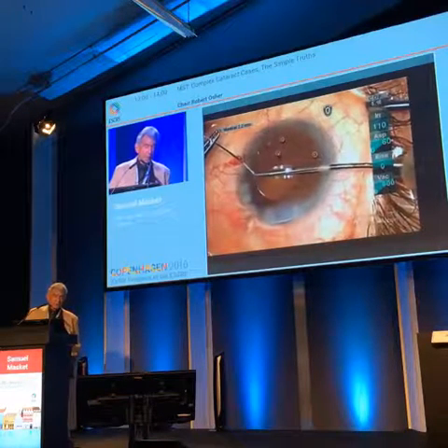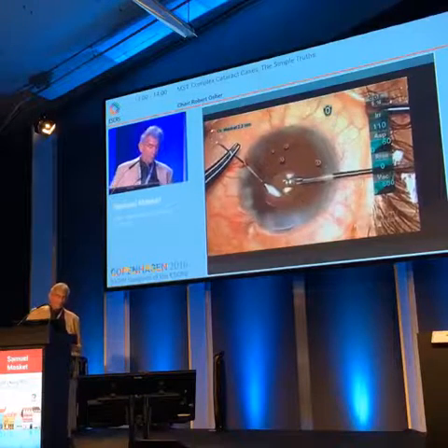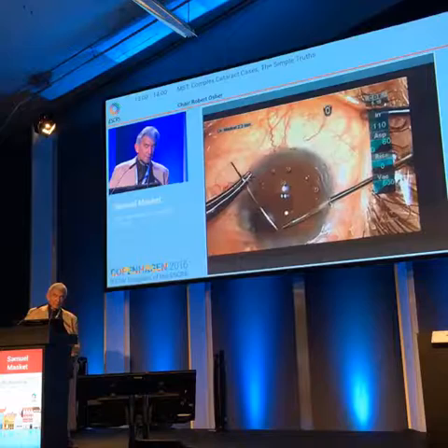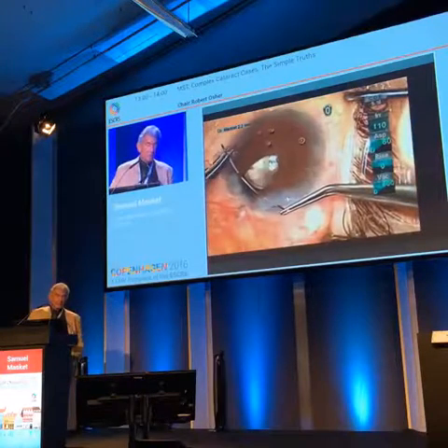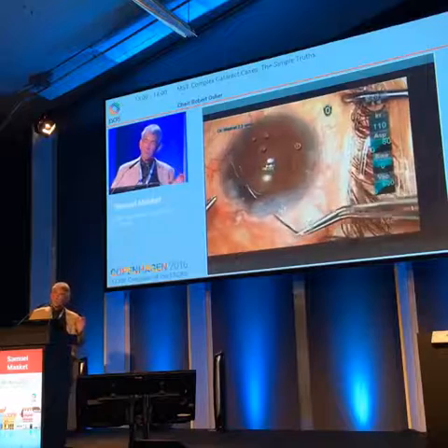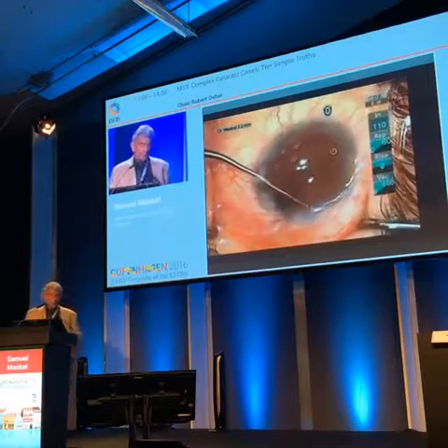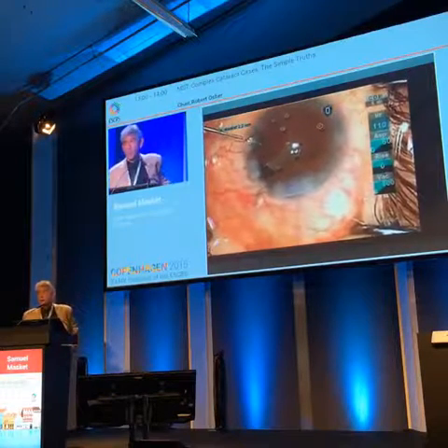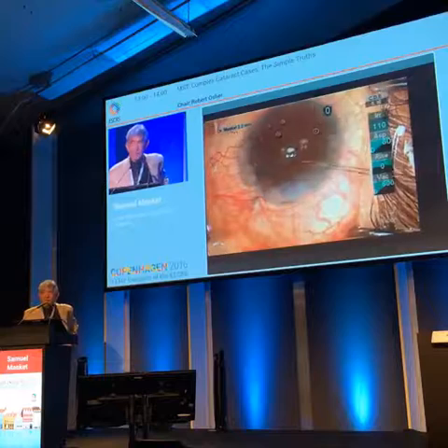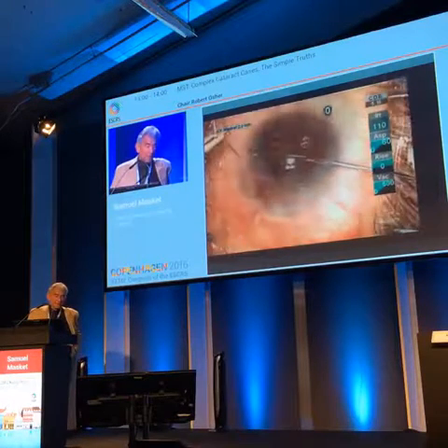So here's a microforceps, and this is a 10-0 polyester suture, and we're going to close the pupil down in order to centralize it. Interestingly, even though we tolerated the eccentric pupil infratemporally for so long in the phakic state, because of the size of the lens, it would be no problem. But in the pseudophakic state, absolutely would not be tolerated. So you have to centralize the pupil.